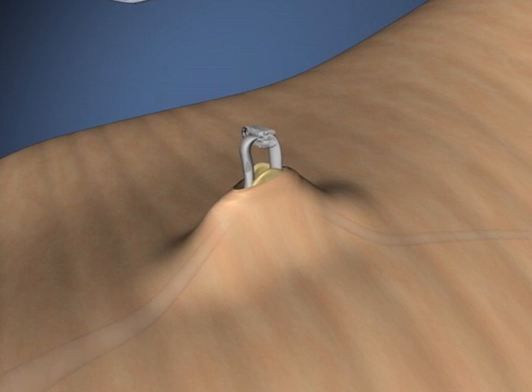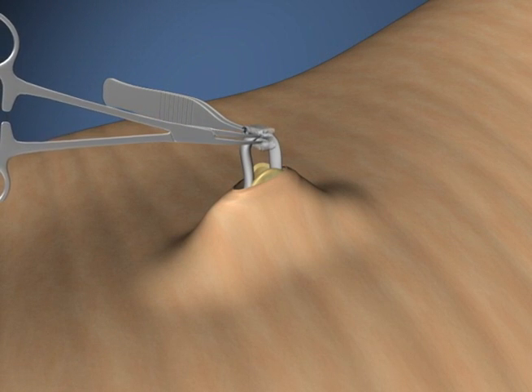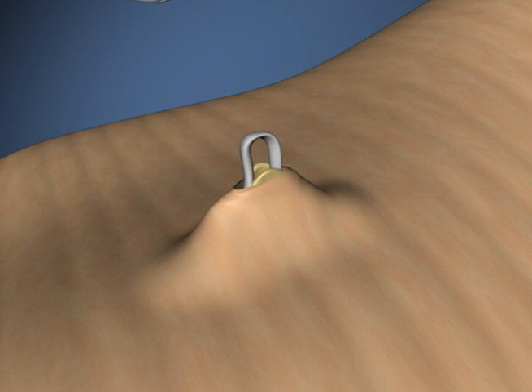If the ProVas clip should need to be removed for any reason, open the two legs of the clip with an instrument such as a pointed hemostat while pulling backwards on the loop end of the clip to remove it.